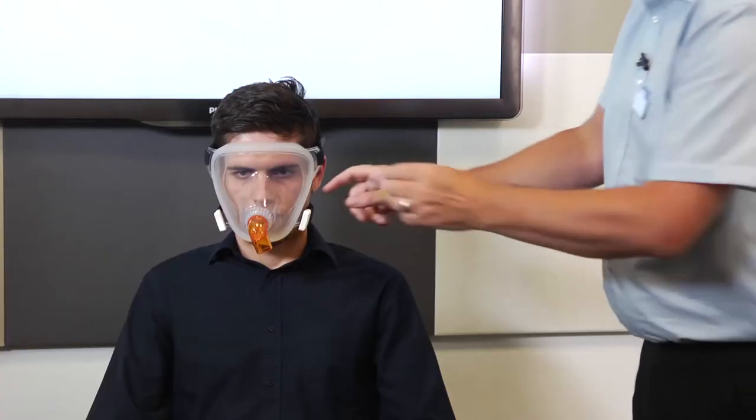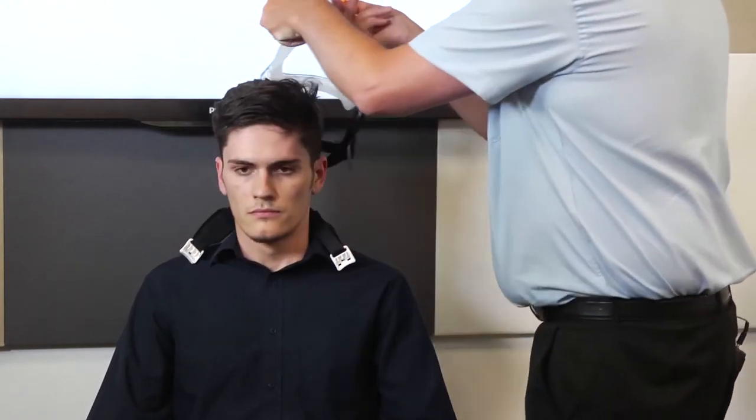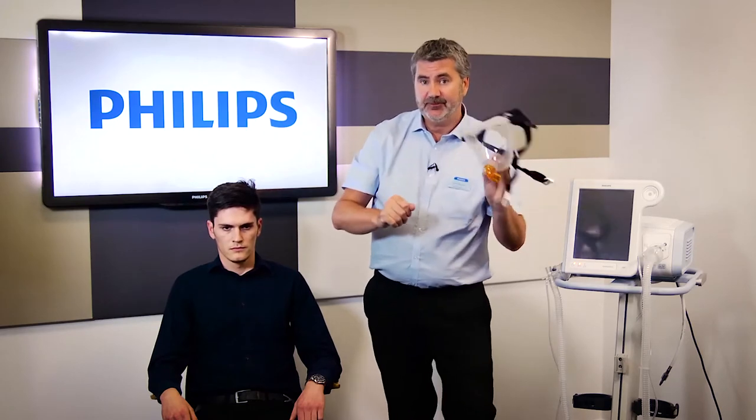And that's the Performax mask. Once it's on, just simply unclip and then you can take the mask on and off. Hopefully you can just pop it back on again and clip it back in position. So that's Performax.